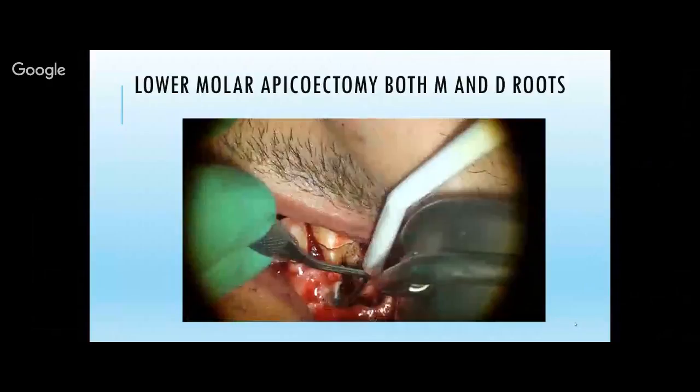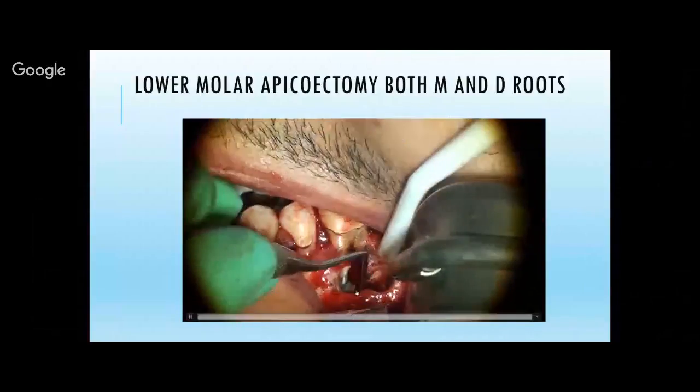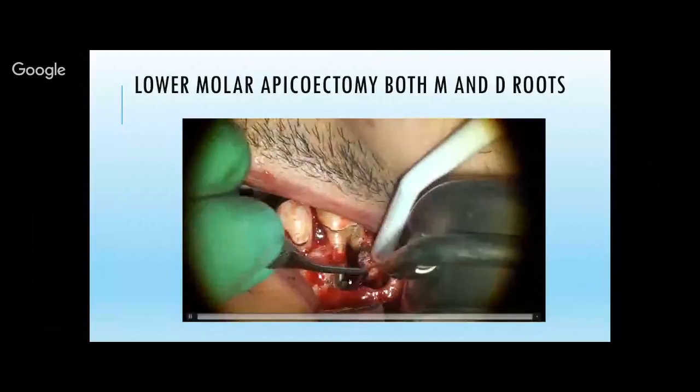Degranulating, make sure there's no debris. And actually at this point, I'm re-stimulating bleeding again because I'm going to place my graft inside, and I wanted the blood to hydrate it and get inside the graft.